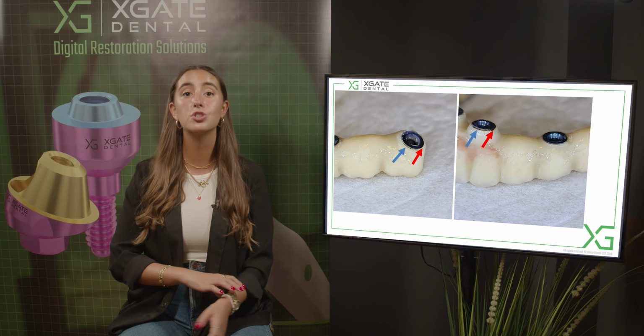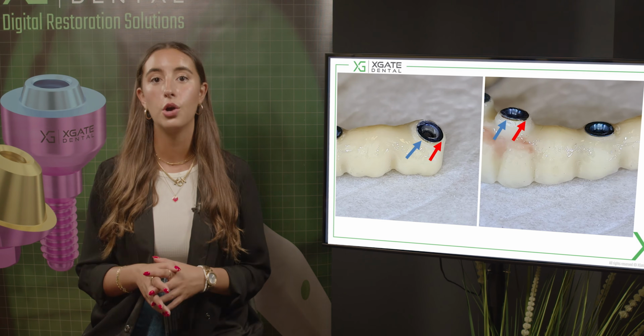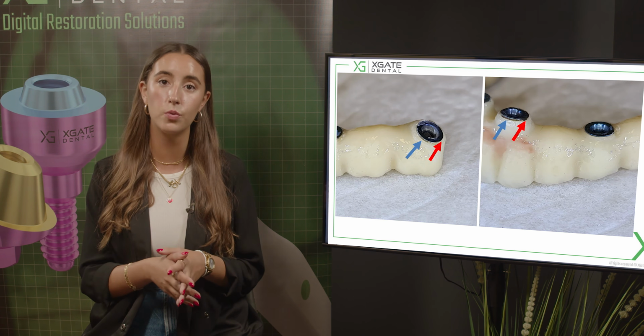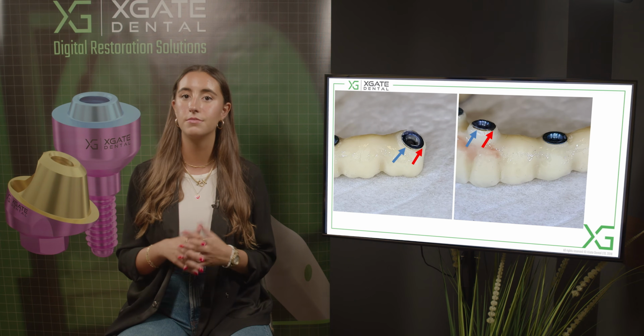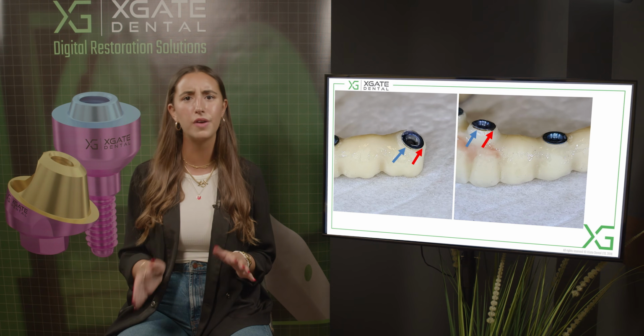The last bridge was the lower one. Now we can say that we have the same with the upper bridge. With cement, the angulated abutments, the angulated sleeves, and then in the second place, we'll cement the straight ones using the same method, the same thing as we talked about before. When we're cementing and you have some saliva or residue of the cement, you just clean it up a little bit. It's actually very easy.